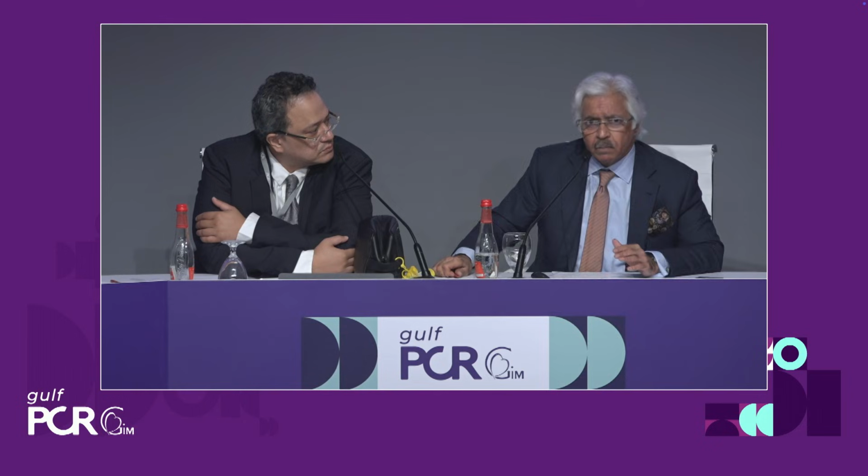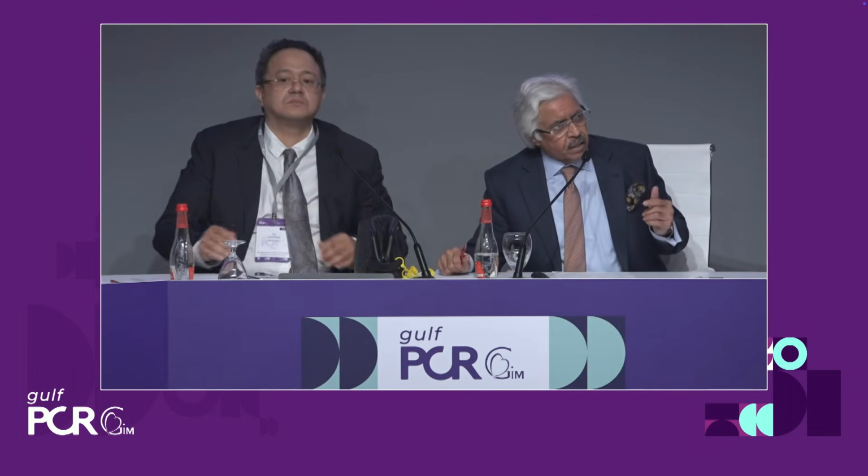So I'm pretty happy today that a valve produced in India was for the world and proved itself to the world in multiple regions and in the hands of numerous operators. Therefore, it's a privilege that we keep moving the science along, keep perfecting. And as we go forward, and Meril brings up new innovations, especially the Octacor and the OctaPro, which we launched in India and started implanting, we see a great future for making TAVI affordable, accessible, and giving quality outcomes to patients across the world.